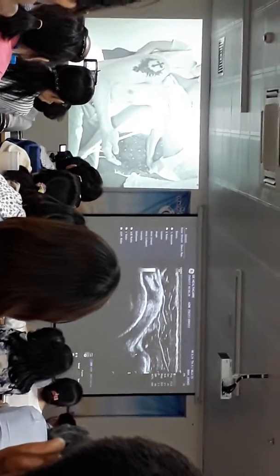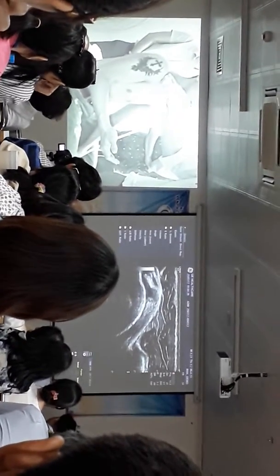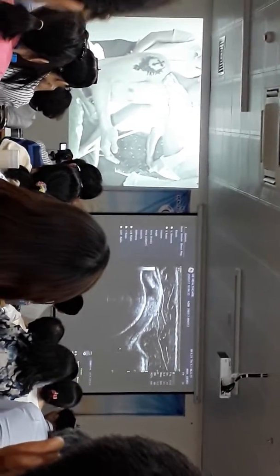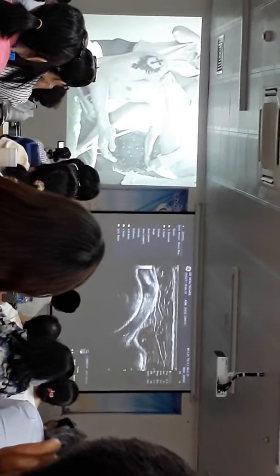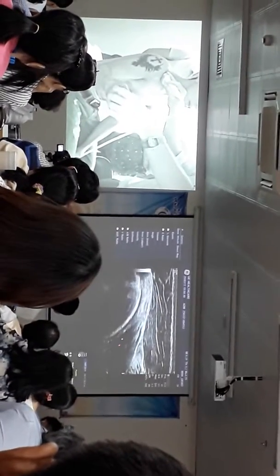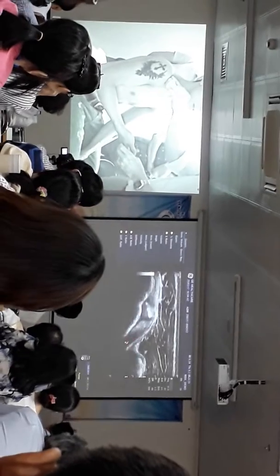This is our coracoid process. So this is the subscapularis tendon coming up from beneath the coracoid. Using the bony landmarks, here is the coracoid process and here is the humerus; the tendon beneath the coracoid is the subscapularis.